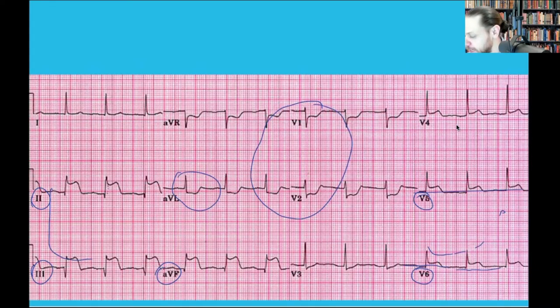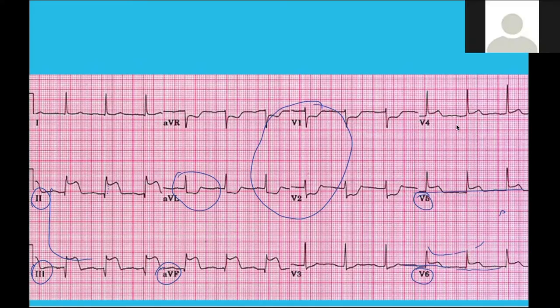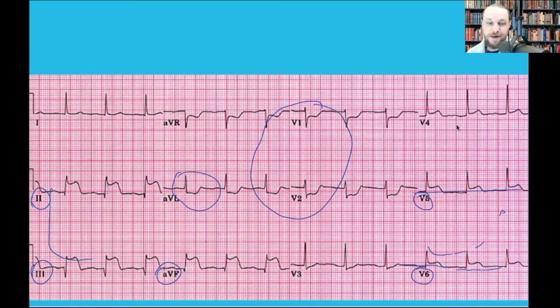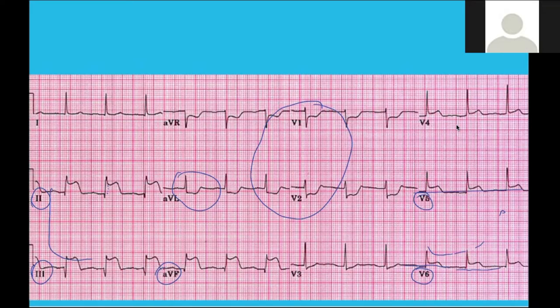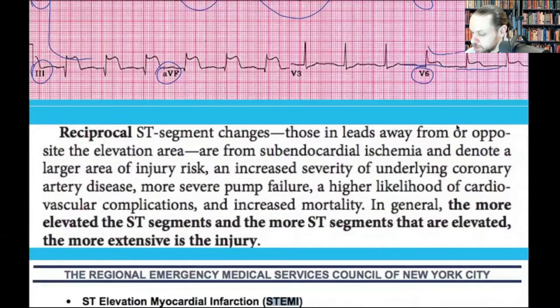How would you call this MI? Inferior-lateral MI — correct. And which coronary artery is involved? The circumflex and probably the RCA, with possible posterior wall involvement as well.